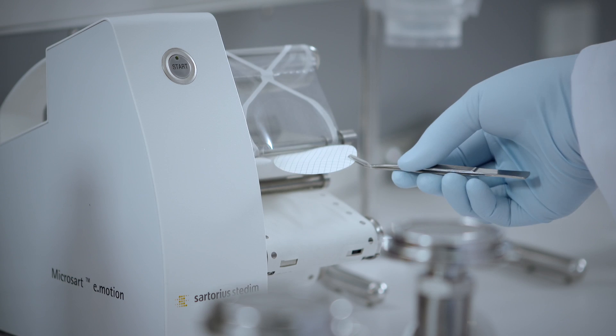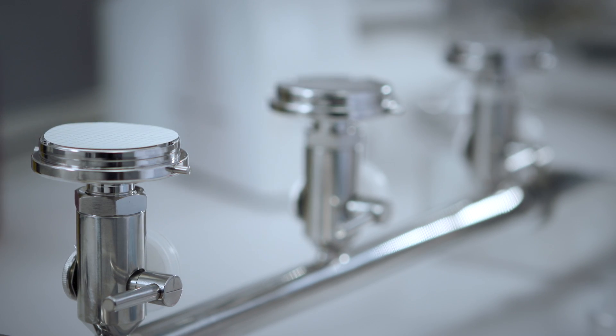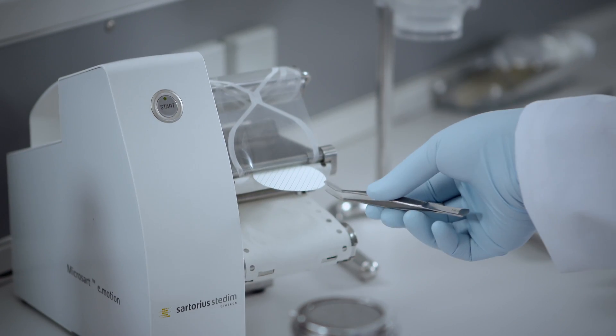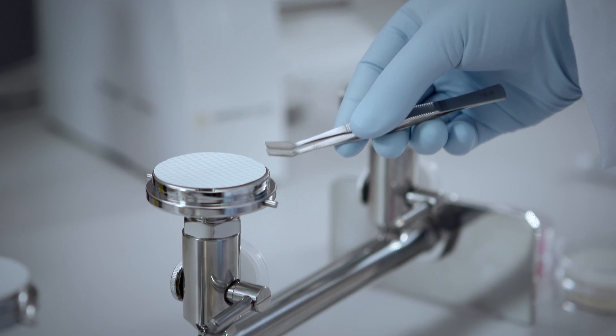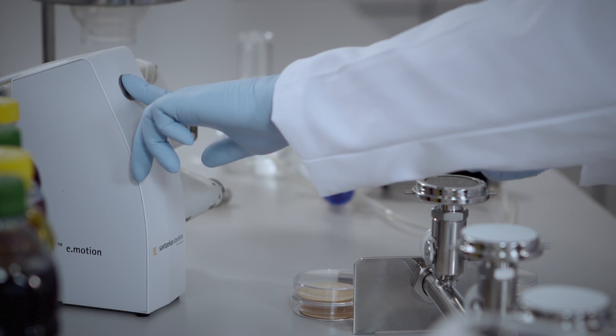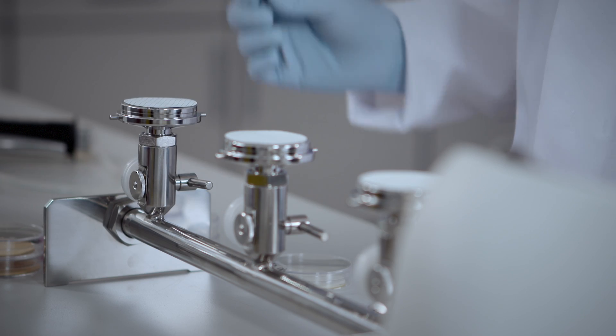The dispenser-ready membrane filters are used with the Microsart Emotion dispenser, which releases the individual filters fully automatically at the touch of a button, or hands-free when the optical sensor detects the approaching tweezers. The Microsart dispenser helps you when high sample throughput and repetitive steps are your daily routine.